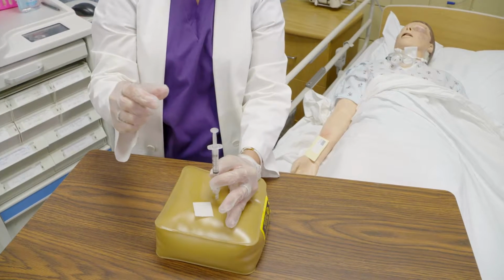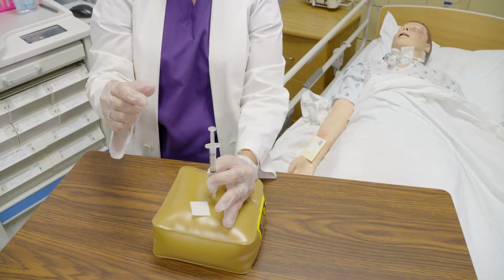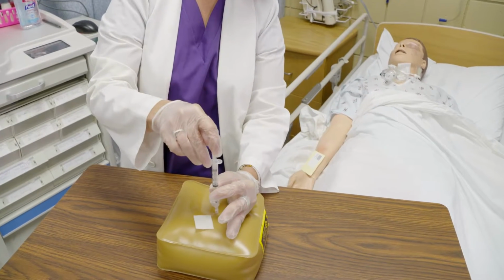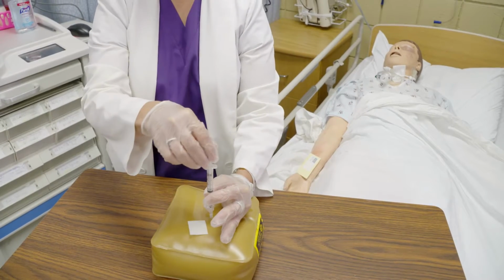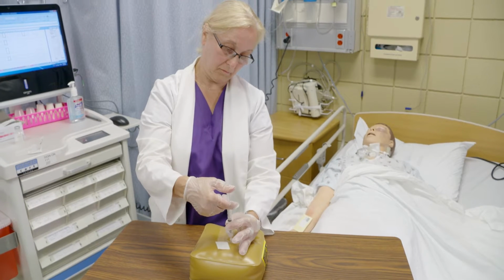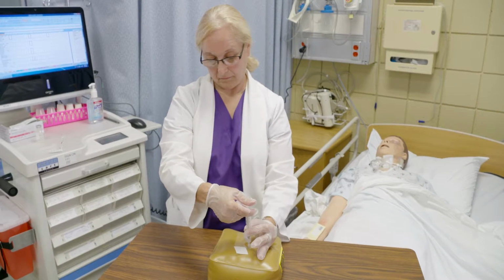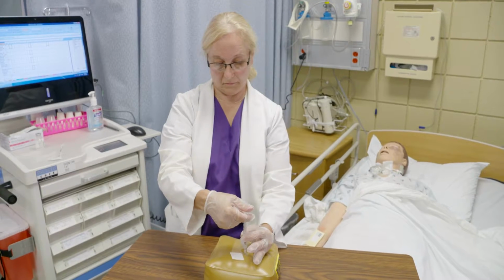Stabilize the syringe by utilizing your index finger and thumb on the non-dominant hand without letting go of the muscle. Using your dominant hand, pull back on the plunger and check to be sure there is no blood in the syringe. This ensures that you are not in a vessel and you are in the muscle. Press the plunger slowly to inject the medication and wait 10 seconds. This allows the medication to disperse and decrease discomfort.